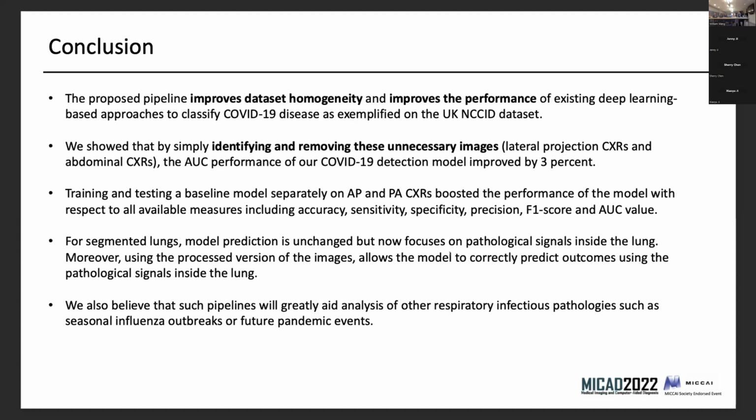I'd like to ask you, so these are chest X-rays, so just 2D images, everything is overlapped. The scanner variability is not as noticeable as with CT. I usually work with CT, where you have different reconstruction kernels. The variability here is mostly the position of the patient and the orientation of the scan, but it's basically a density-based method. Radiation goes through the image. Okay, thank you. Right, thanks.